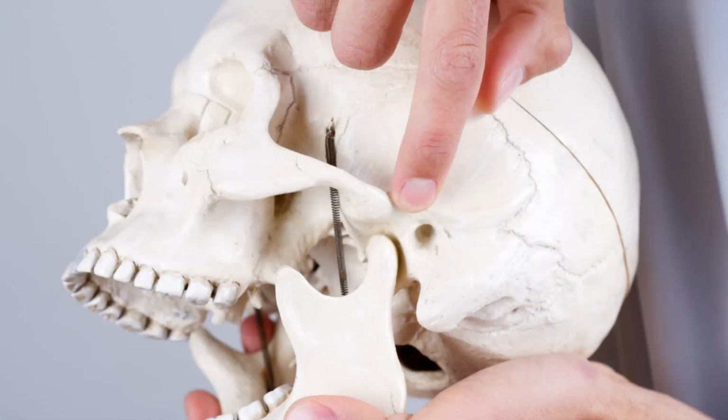And in most of the people who are suffering from parafunctional habits or bruxism and clenching, bruxomania, even TMDs, disc displacement and reduction, all those things do not have a proper centric relation, because of which the whole complex of the jaw joint with the jaw cartilage, the fibrous disc, the TMJ assembly, the fossa, all those things, and the muscles all together are not in harmony, because of which you feel that other kinds of symptoms arise, and that might lead to you having fatigue or degradation of the quality of your life.